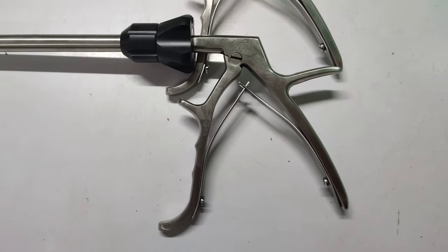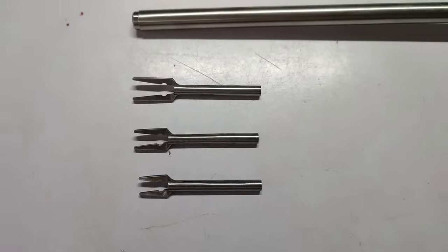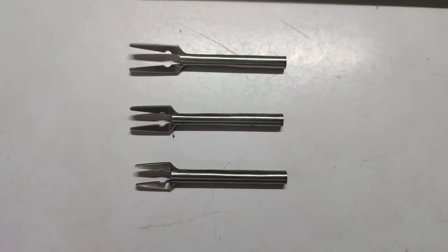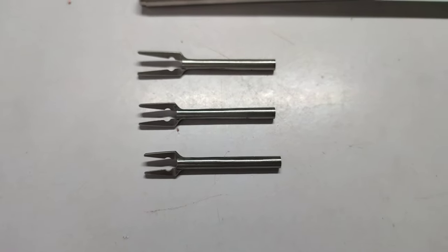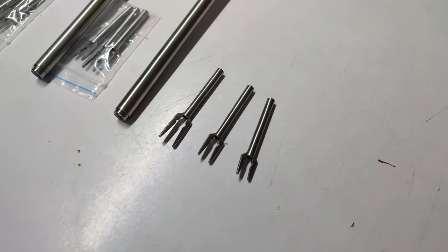This is a rotatable handle. These are 3-in-1 clips — large, medium, and small jaw. Here I am going to show you how to apply these clips with the clip applicator.